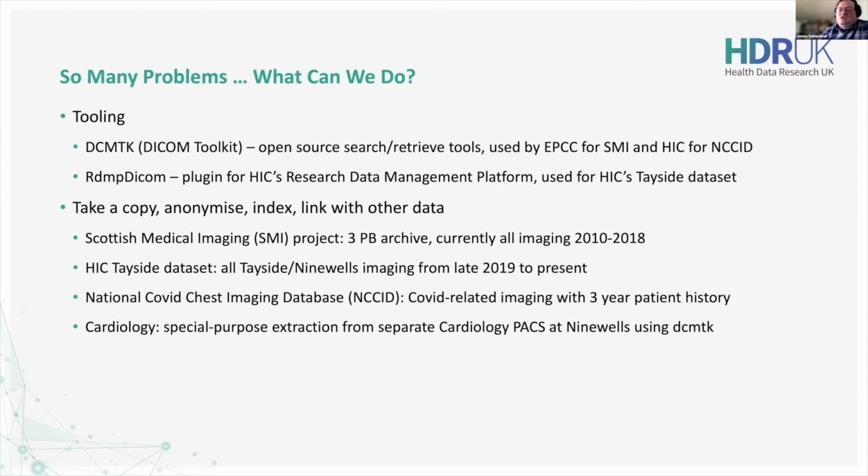And one of the next frontiers for it is moving into medical photography. Again, they currently do their own thing. They take photographs of people's rashes, skin lesions, that sort of thing, and they currently store those just as regular photographs, like you might on your Flickr account or Facebook. And there's some work underway to bring that on board with the standard that other medical imaging uses, structured better with DICOM, which would make research more efficient.